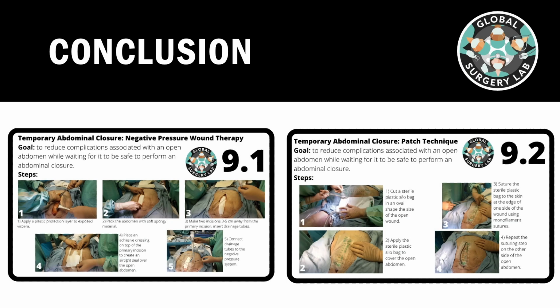In conclusion, a temporary abdominal closure is a technique which can help to reduce complications associated with an open abdomen, while waiting for it to be safe to perform an abdominal closure.